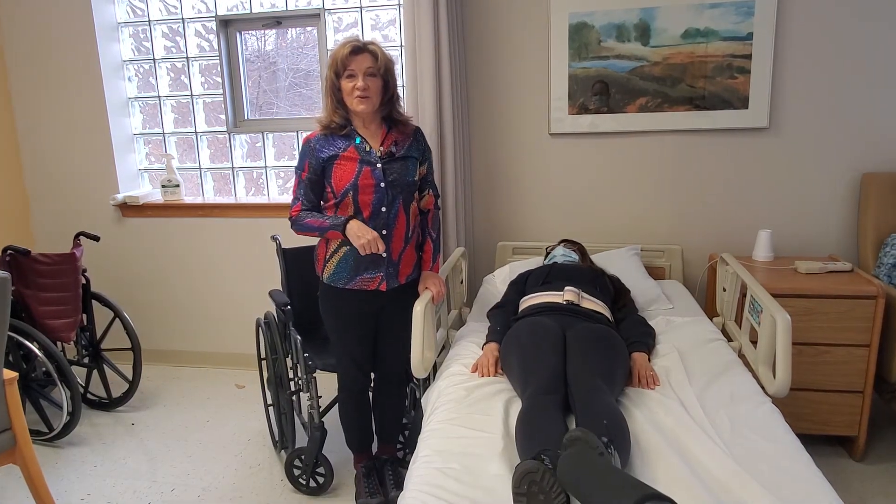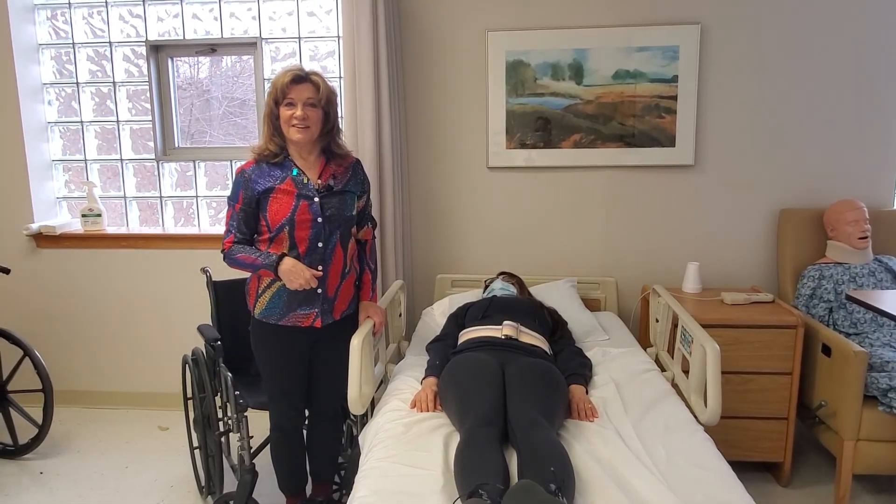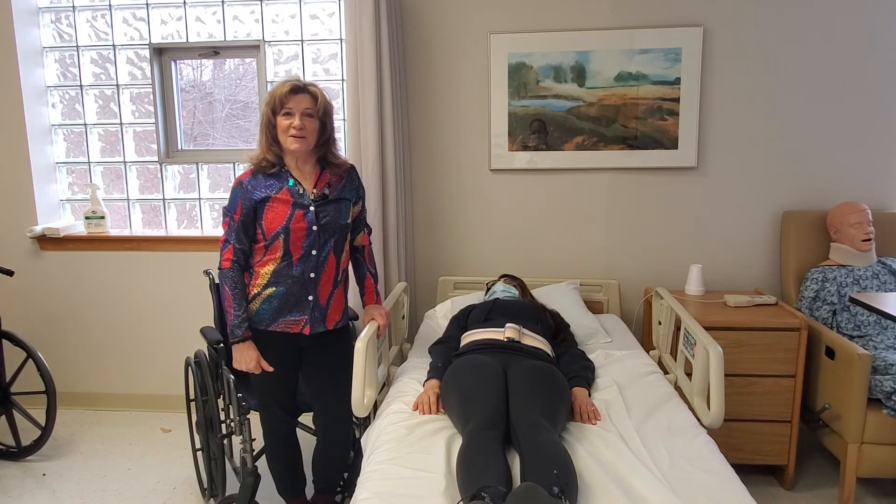You can bring the bed up to height. That's how you get somebody in and out of a hospital bed with a wheelchair. If you have any questions, you can email me at NancyDNP at gmail.com.